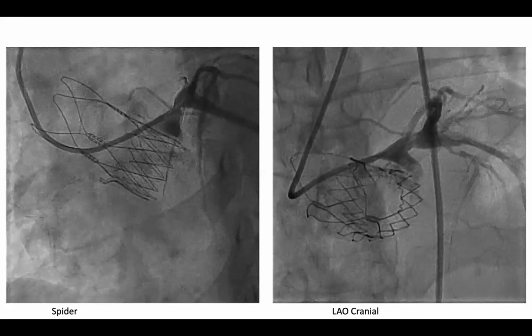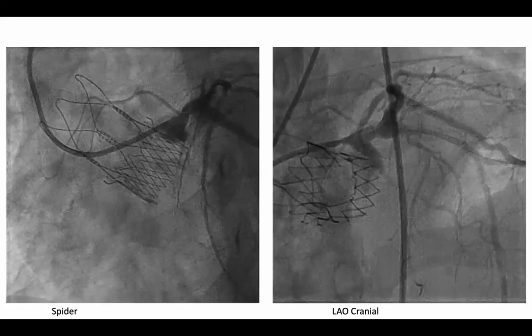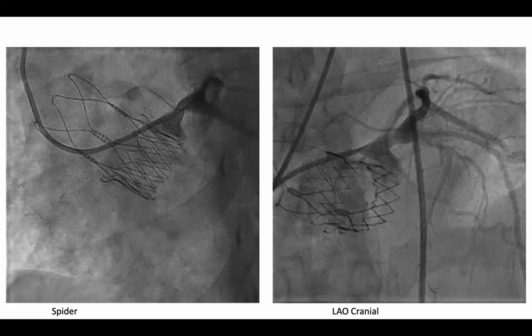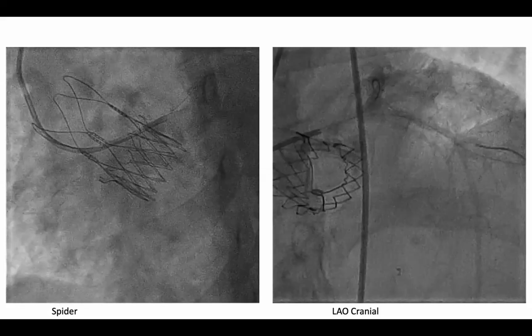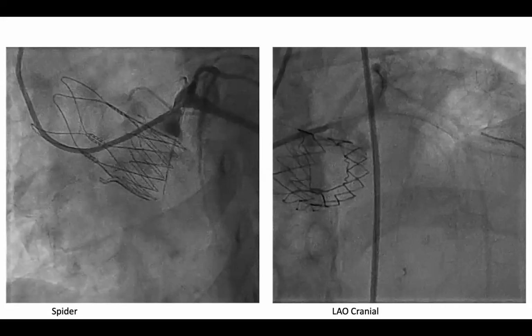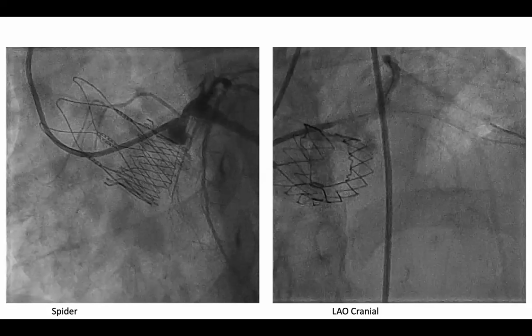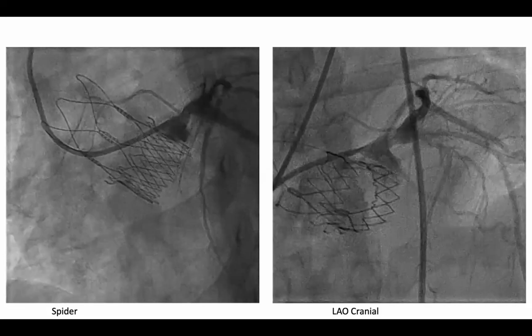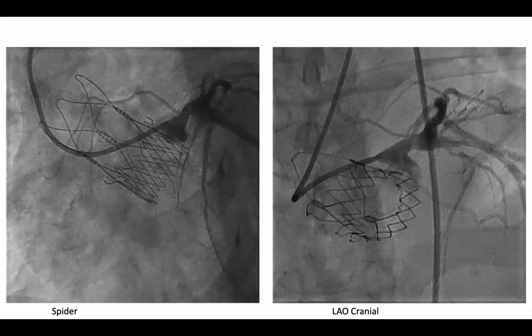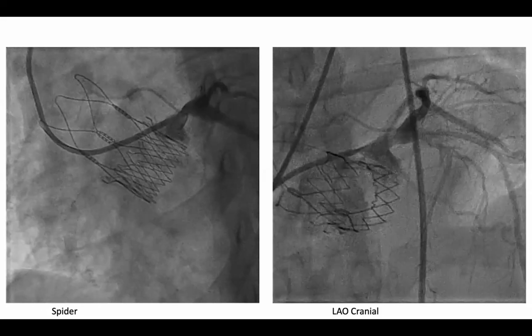Although we did not have any upfront echo for this patient because she landed straight on the cath lab table, the history was suggestive: sudden onset chest pain in someone known to have mild left main stem disease from 3 months ago, and also a quite changed ECG. Compared with the ECG from 3 months ago, the patient had new left bundle branch block, ST elevation in aVR, and ST depressions in most of the leads.